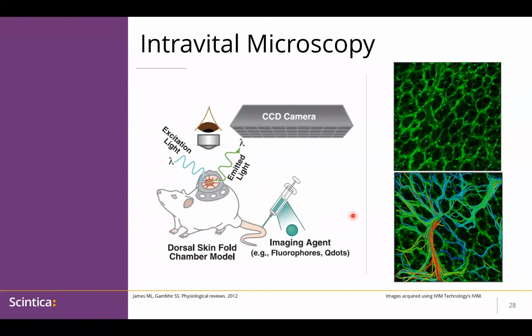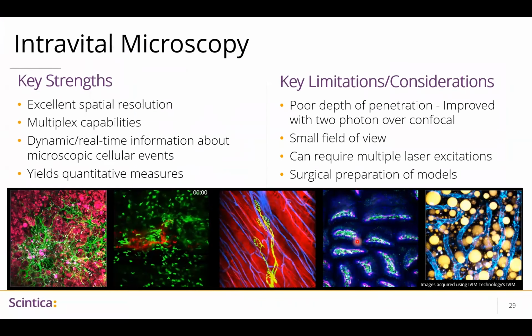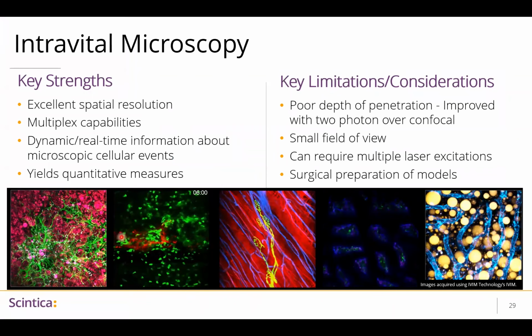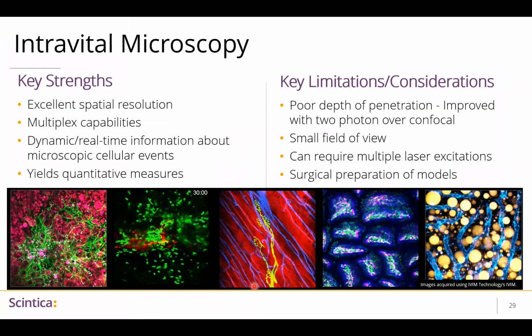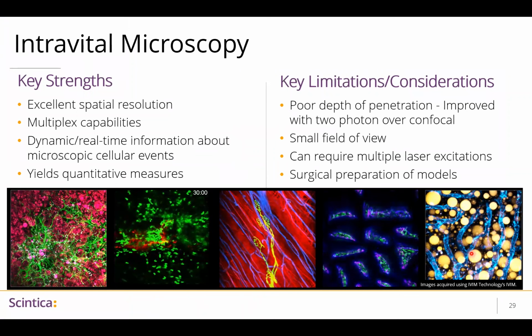Here we're looking at the movement of cells through a specific structure, and we're able to track where those cells go through. So here are some amazing images of different structures, which always amaze me when I get to see them. We can see here an inflammation response where I believe these are neutrophils homing to a site of inflammation, neuromuscular junction, colon, fat in the liver, with tremendous resolution.